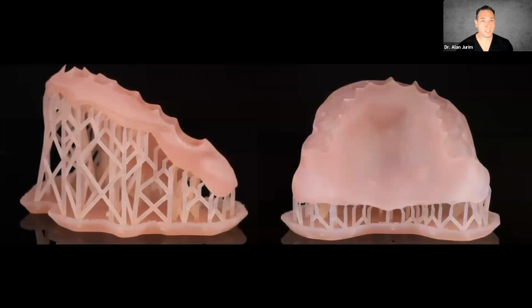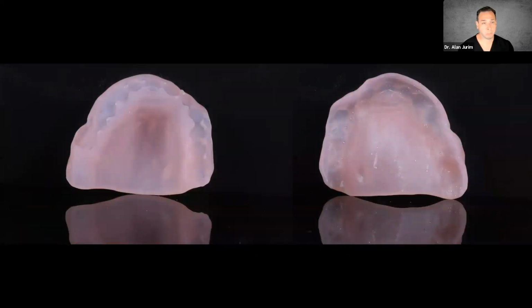So here's what the denture bases look like when they're printed. Those are the supports. We print them on an angle. The time to print here is a couple hours. It's not too bad. And we go ahead and we have our printed denture base.